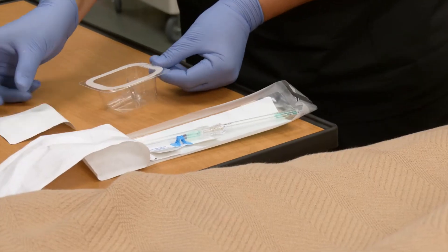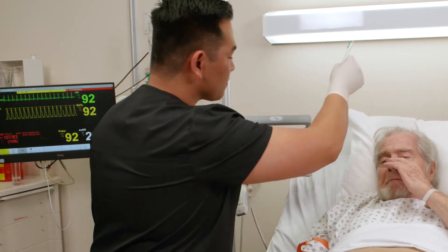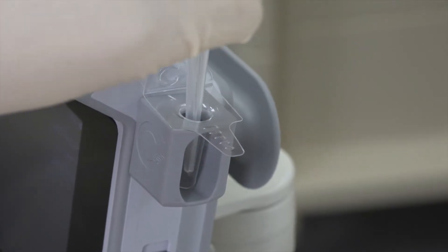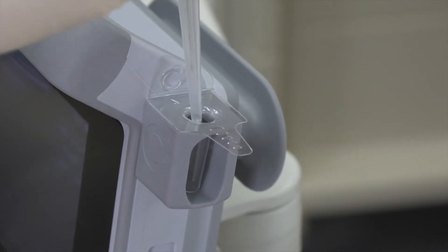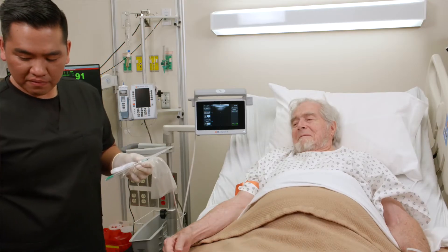Remove the device from the packaging. If desired, use a magnetizer cover. With the needle cap still on, magnetize the needle by dipping it into the magnetizer for one second and pressing continue. Please note that there will be no sound when magnetizing.